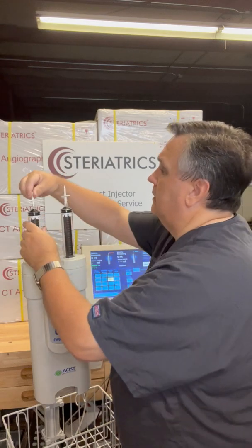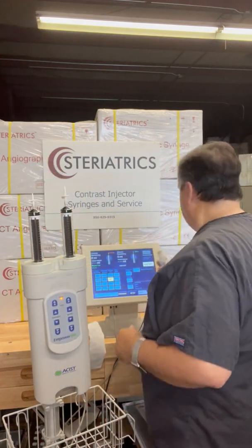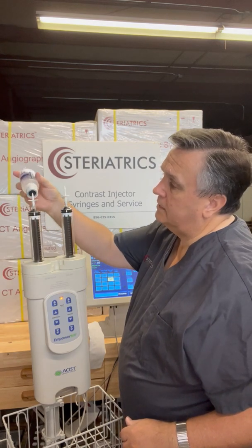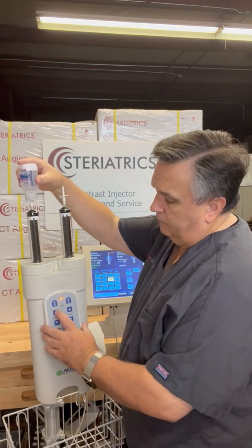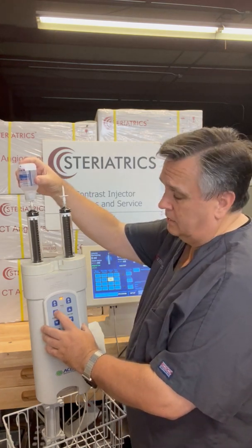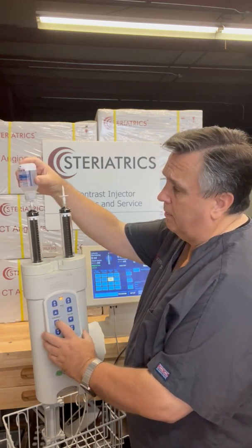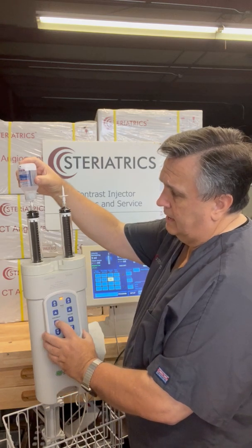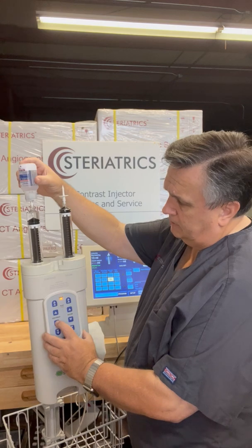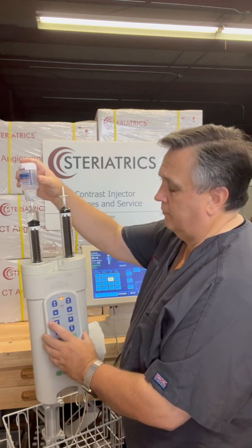Now we're going to fill. I'm going to start out with contrast. We're going to hold it on the angle so we see that bullseye, press down, and then we want to fill. We're only shooting 20 — we normally only shoot 15 to 20 of this — so we're going to take the slow button, press and hold, because as soon as I release it's going to stop. I can see there's 20 in there and shut it off.